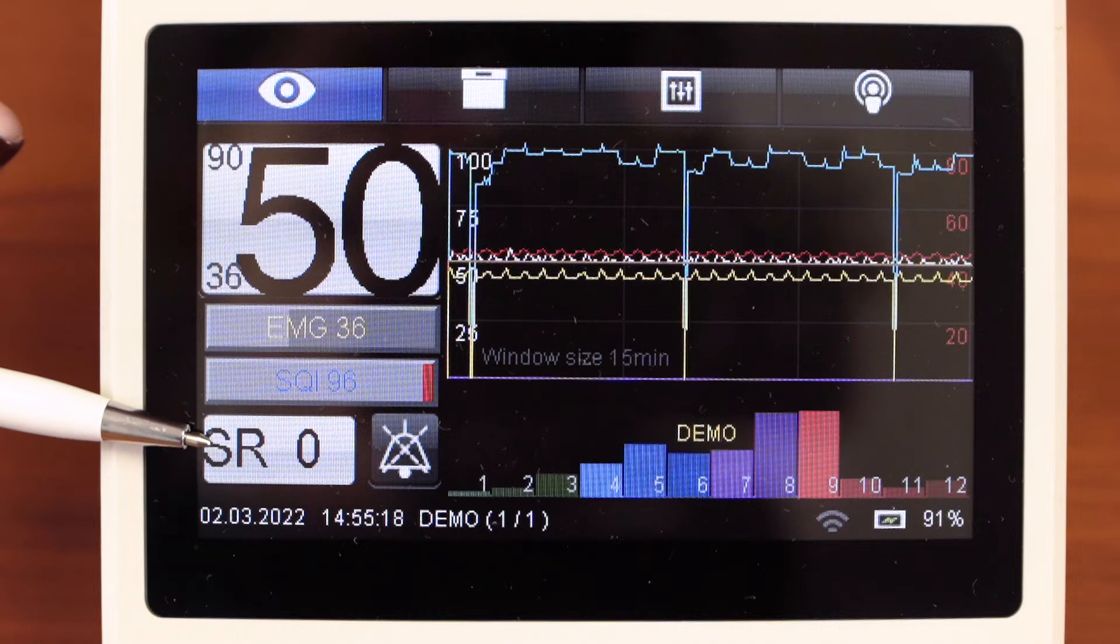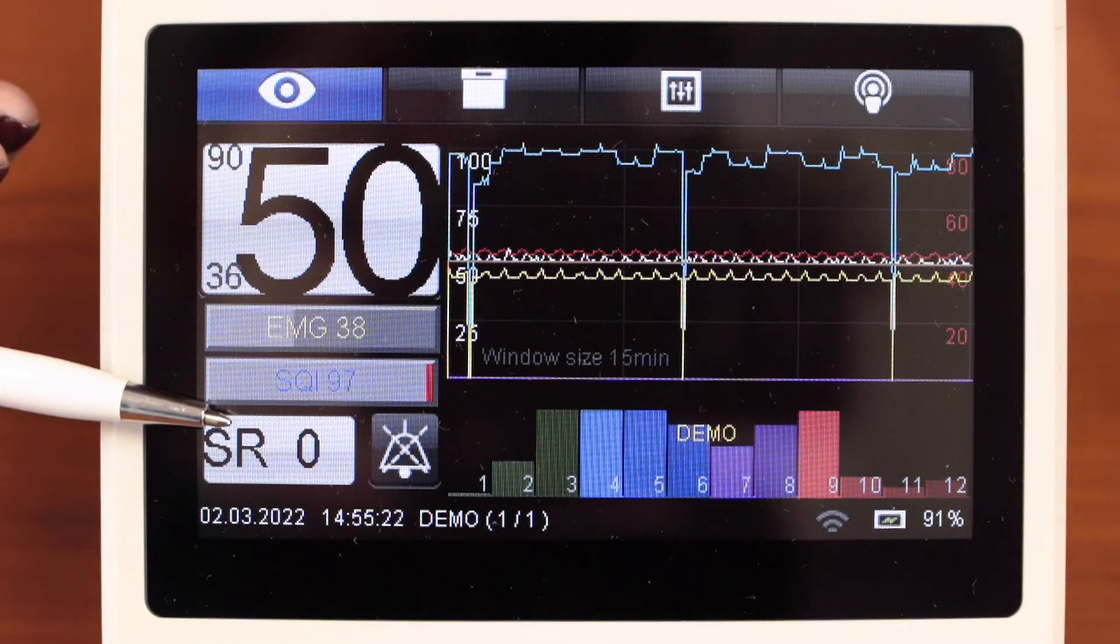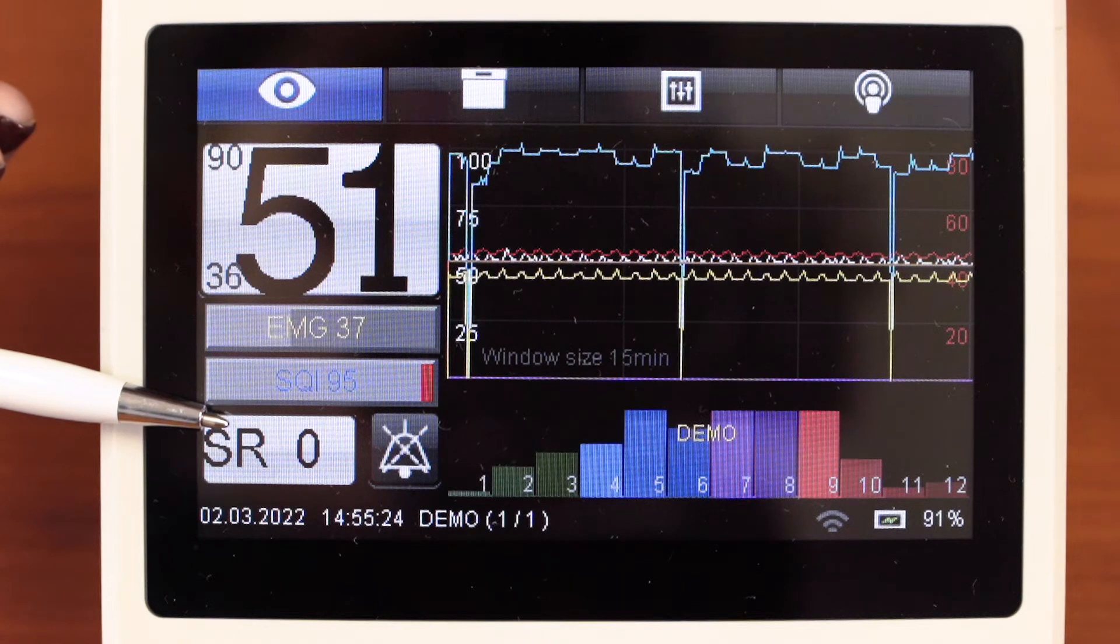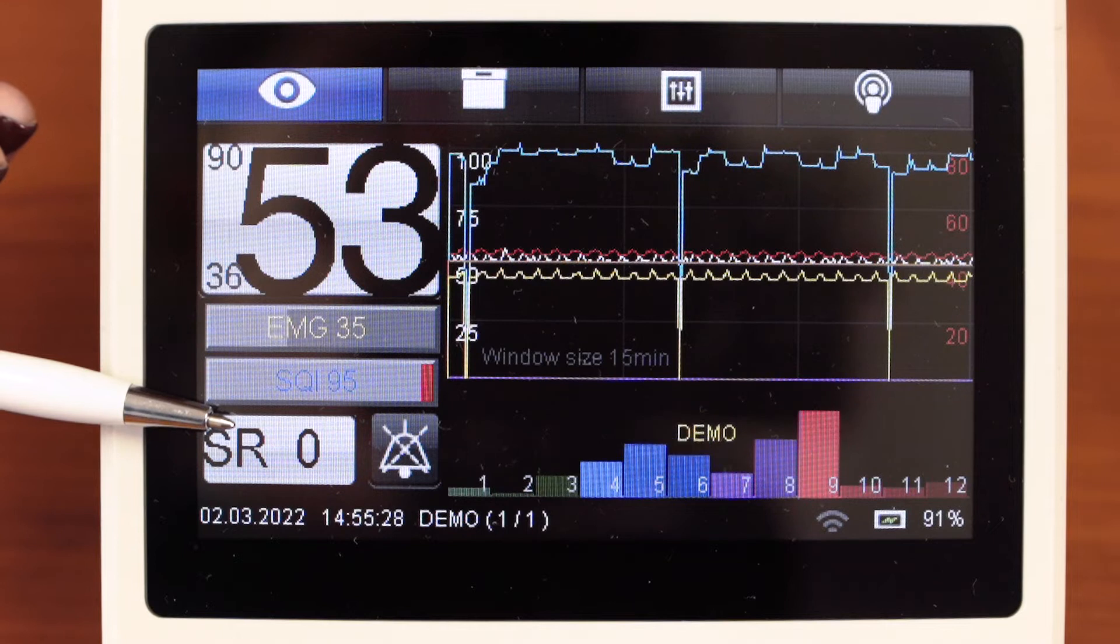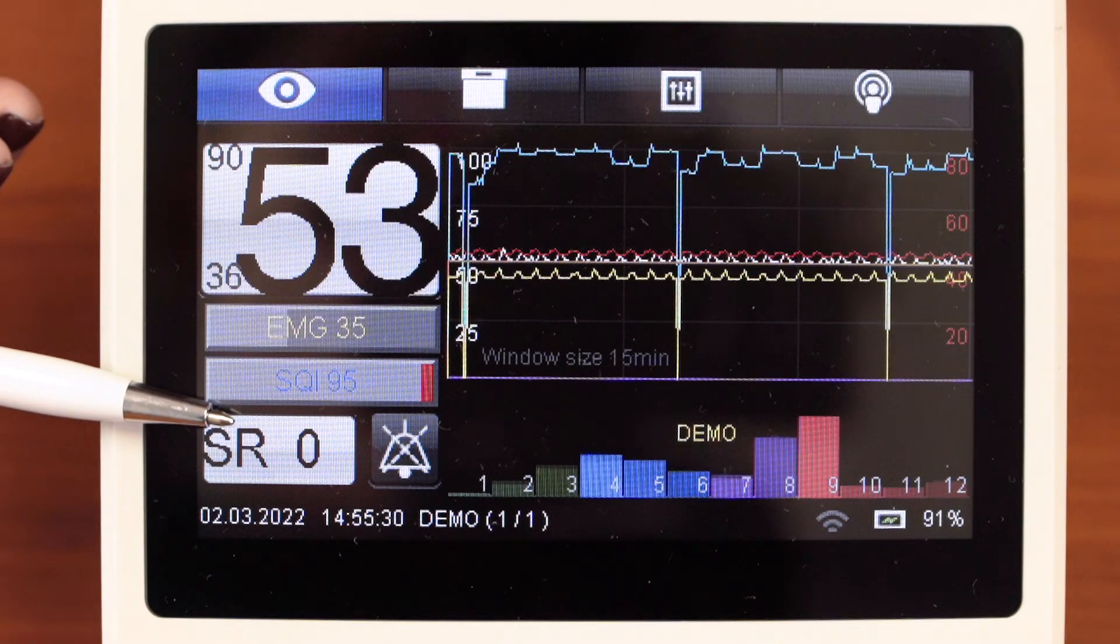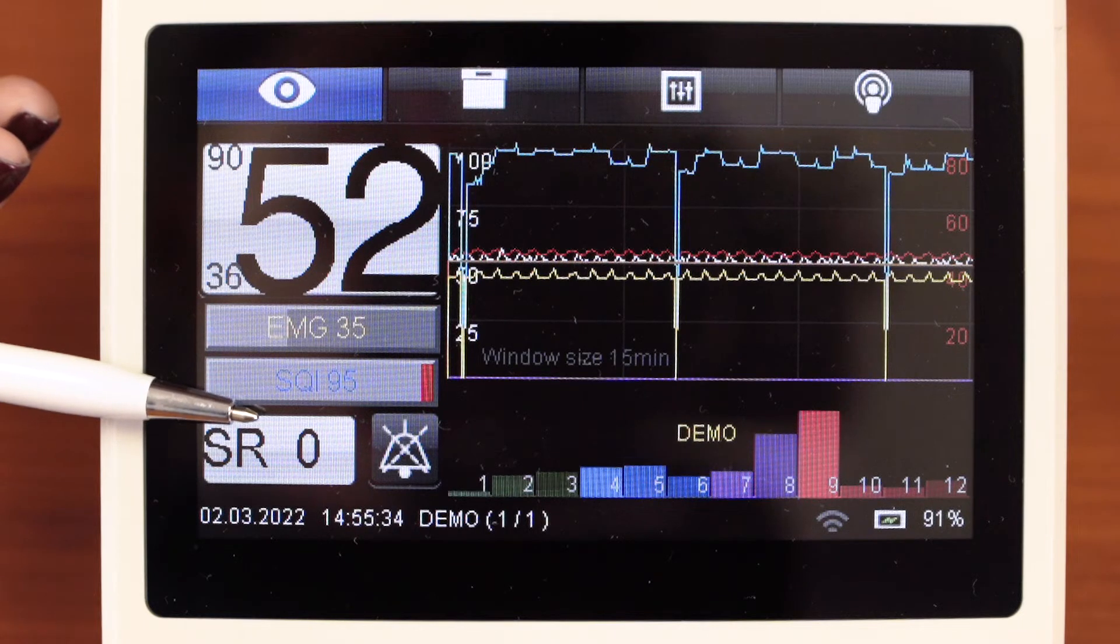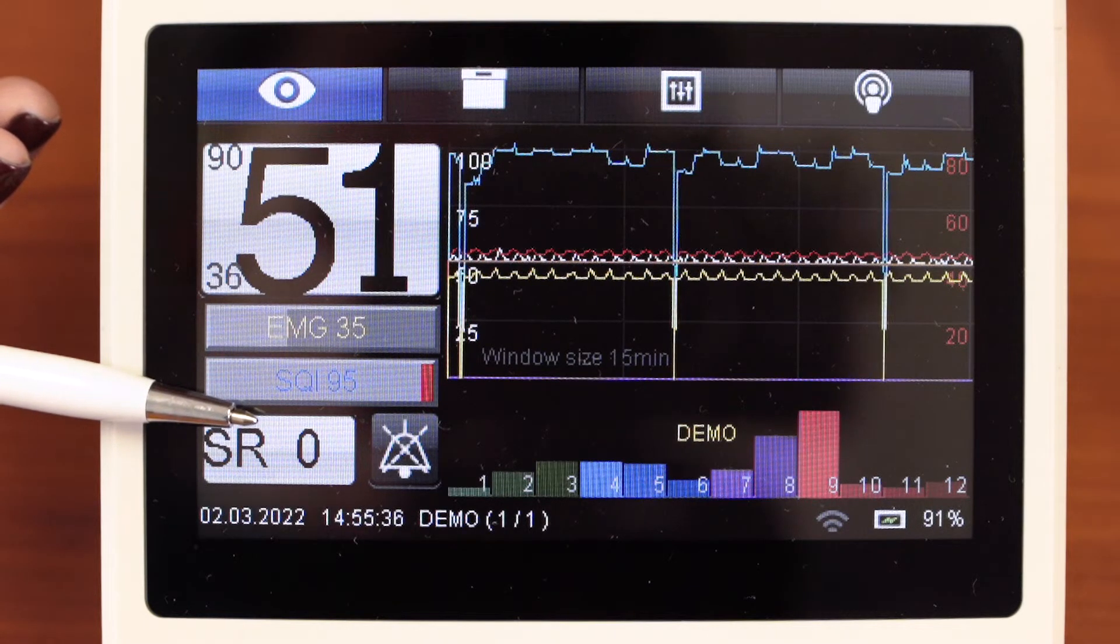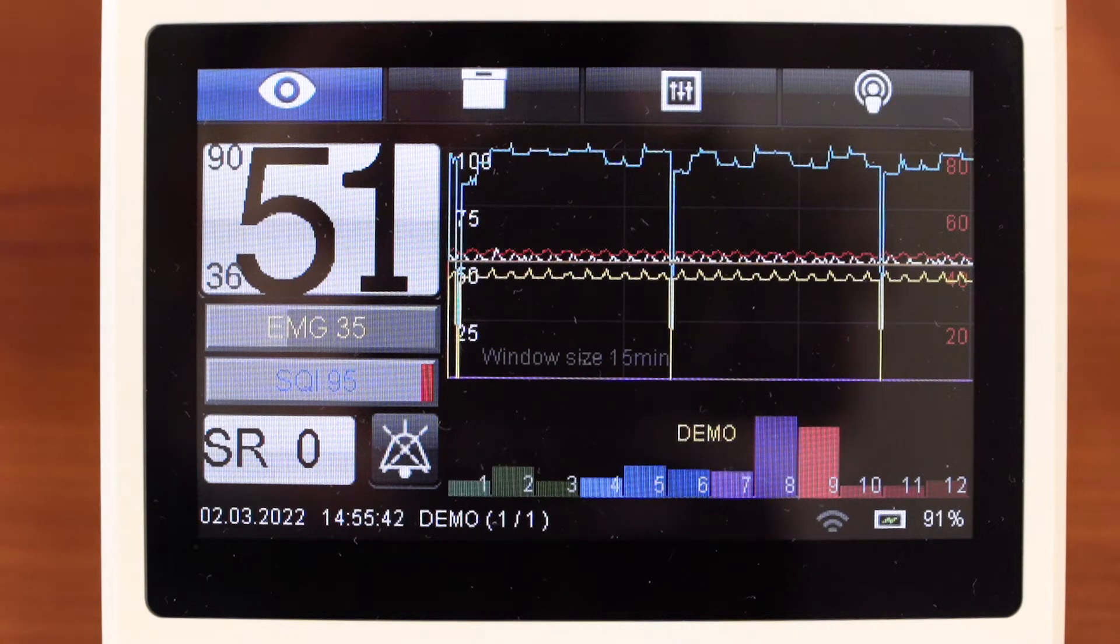Suppression rate is 0. It means normal EEG signal. If suppression rate more than 0, it means there are suppression parts close to isoelectric line on EEG signal. Suppression rate expresses in percent the total time of suppression EEG fragments for the last minute of measurements. Physicians have to follow the dynamics of changes of all values.